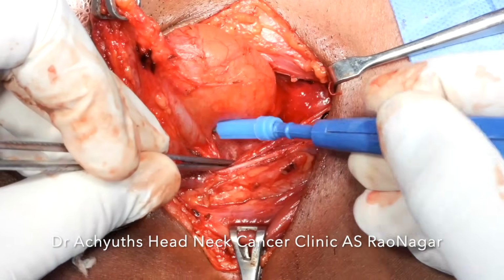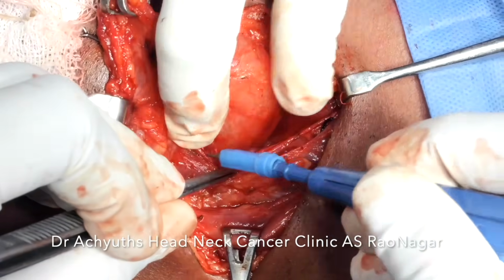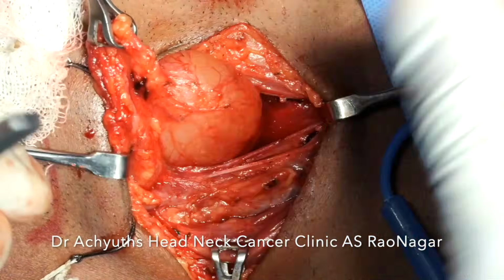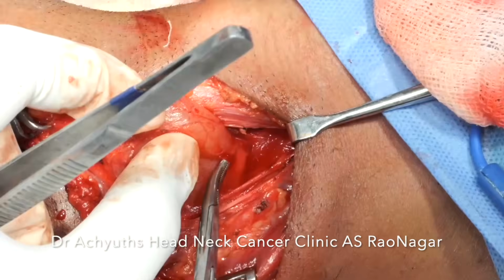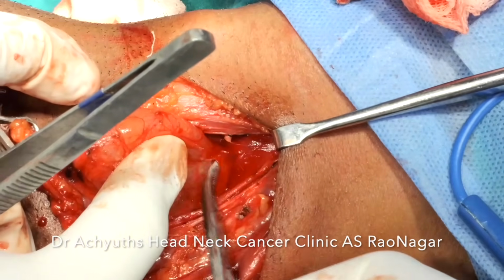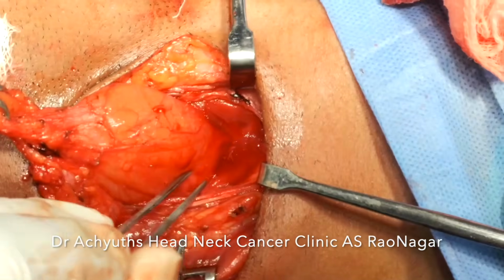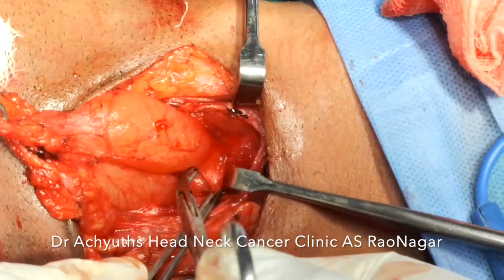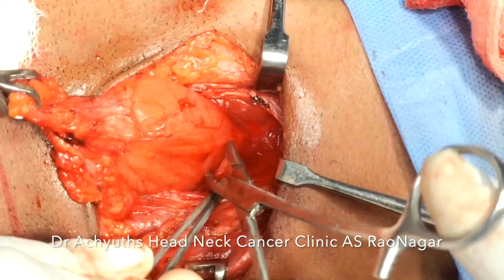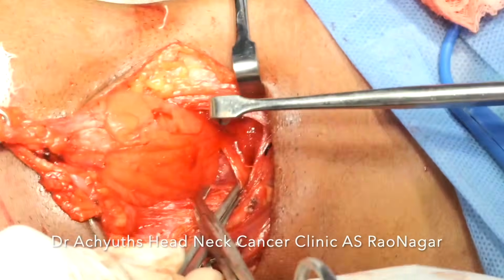But here we have to identify that we are almost in the carotid triangle, so high wattage of the cautery, or inadvertent poking into the deeper structures, or damaging the carotids, IJV or the vagus nerve should be carefully gauged and then done.